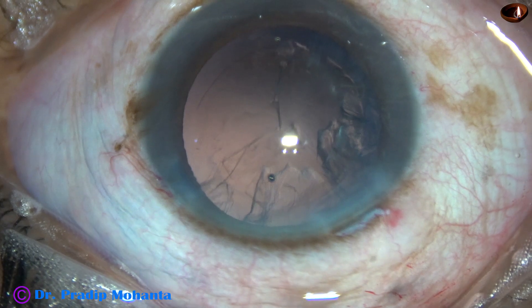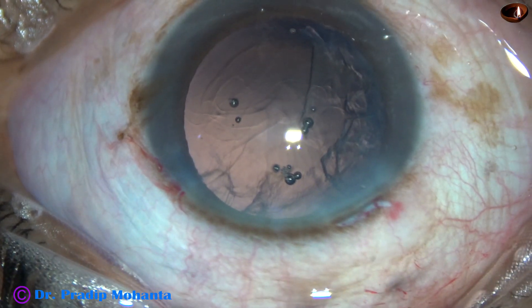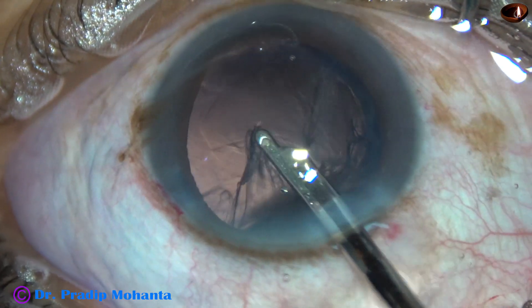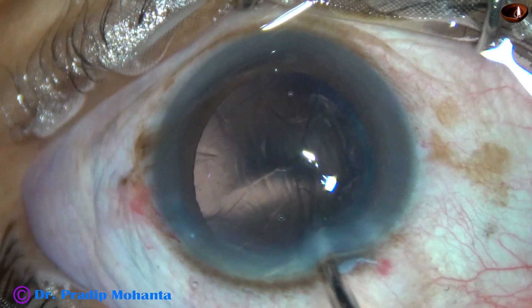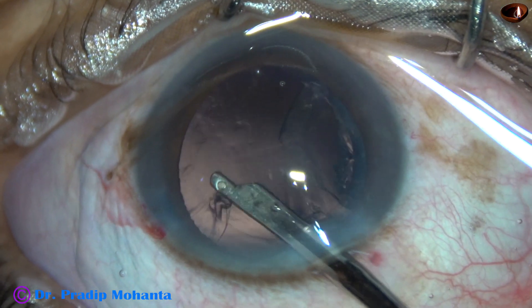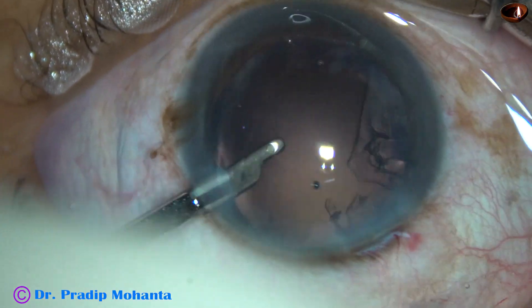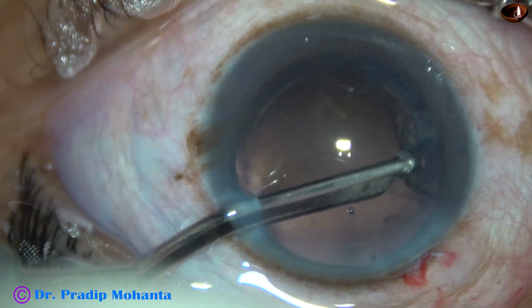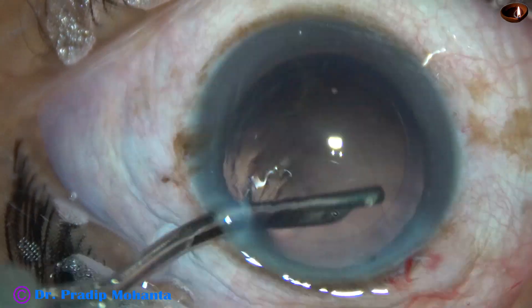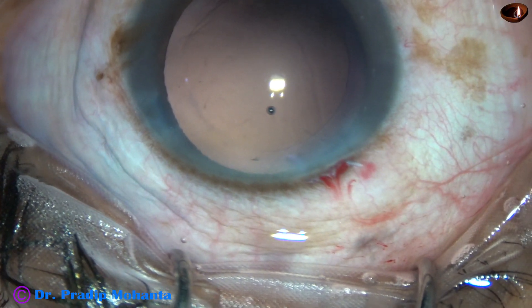Now I come out, inject some more visco 2% HPMC, and then use the 23G Simcoe cannula to remove the rest of the cortex. Going through the side port, which is 90 degrees away from the main incision — astigmatism produced by the main incision is neutralized to some extent by this side port.